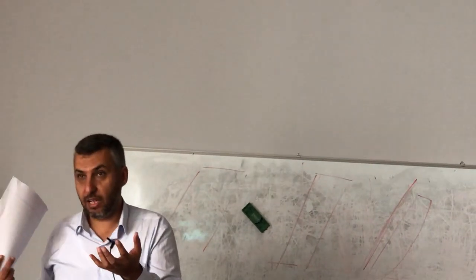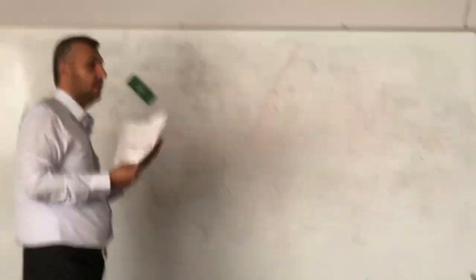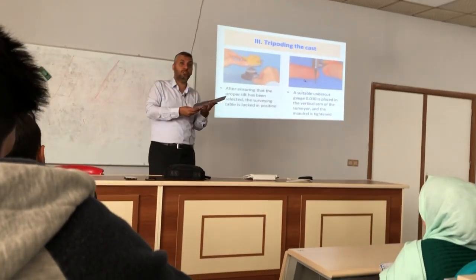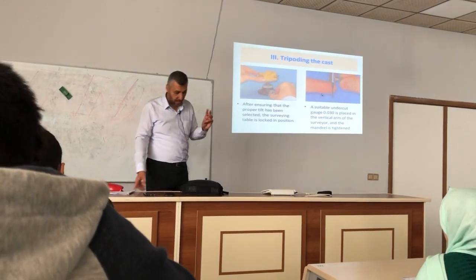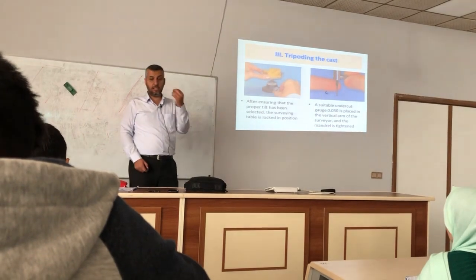Just as a reference, when I want to remove the cast, it gets back to its exact position. It does not affect the survey line, has no role in the survey line, just a reference, only a guide.